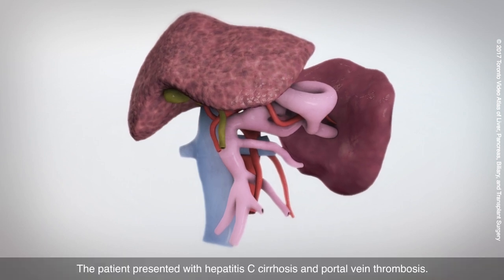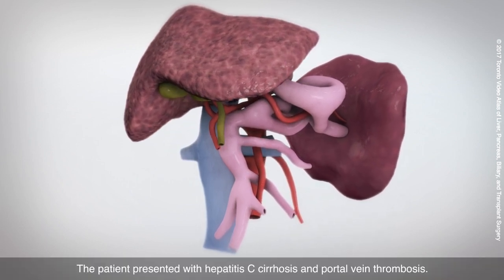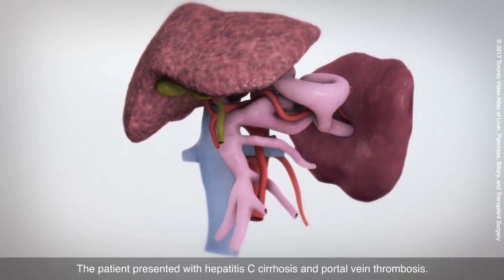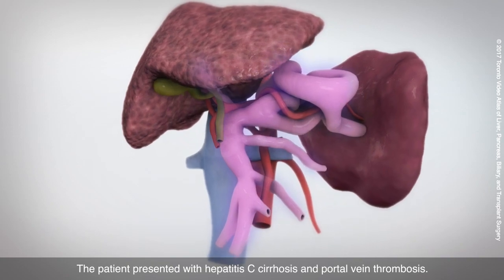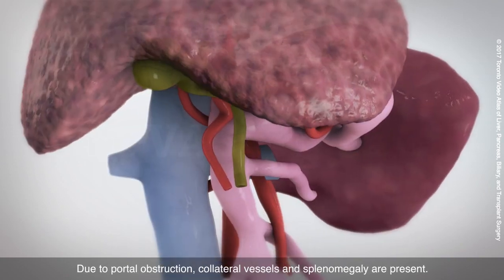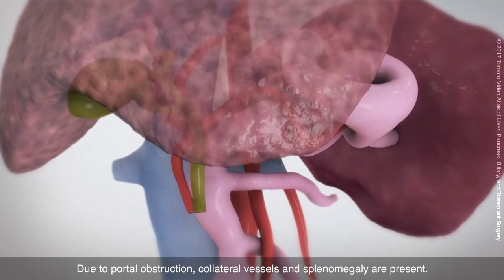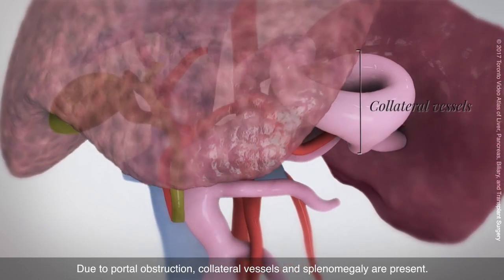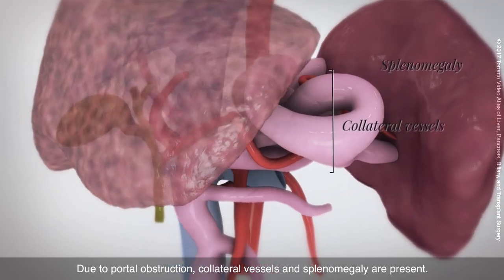The patient presented with hepatitis C cirrhosis and portal vein thrombosis. Due to portal obstruction, collateral vessels and splenomegaly are present.